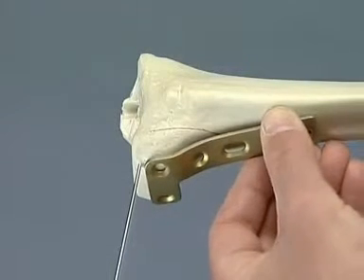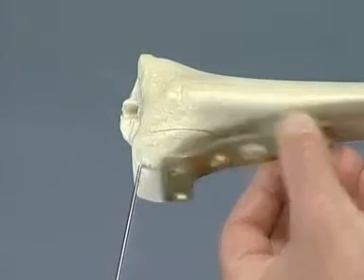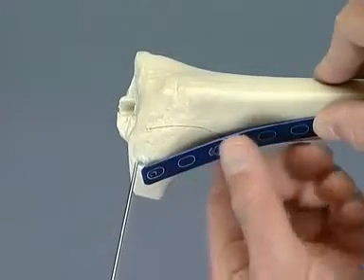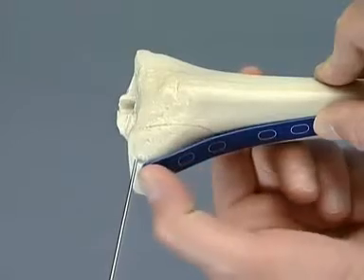Contouring of the L buttress plate for the lateral side of the tibia. The curvature of the plate may have to be adjusted slightly. A bending template can be used to determine the degree of adjustment.